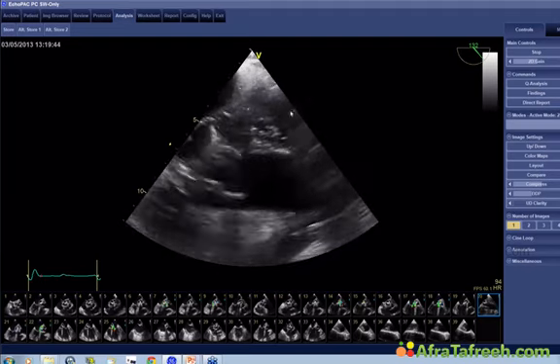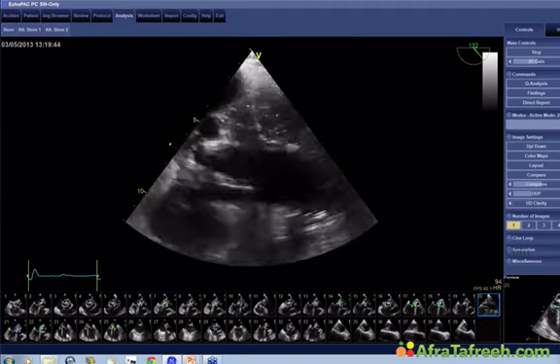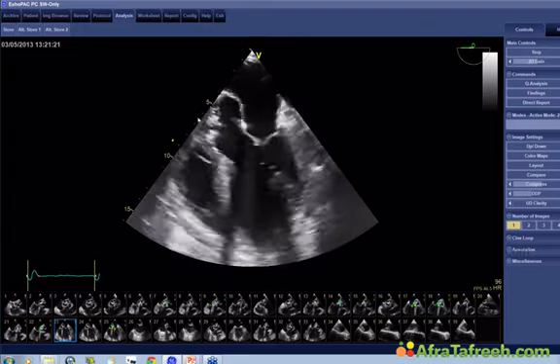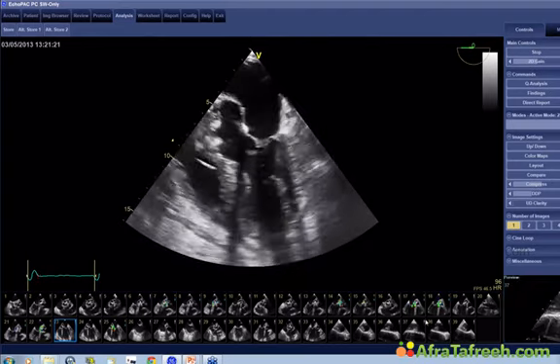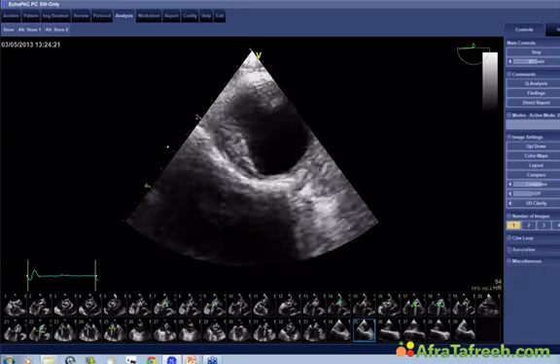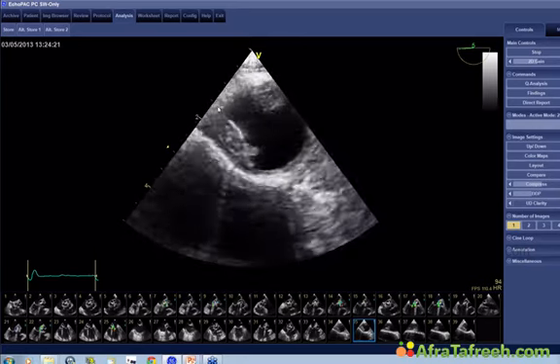Okay, so again, this is the pseudoaneurysm here. So a very, very dramatic finding. Here again, you have the disconnection in the intervalvular fibrosa here. This is the aortic valve, which bounces back and forth. Here again is the pericardial effusion. But when we pulled the probe back, we found another thing. This is the aorta. Look at the aorta and look at this mobile structure here.